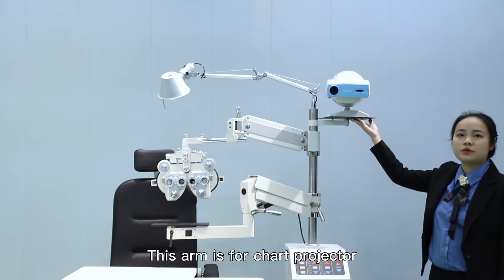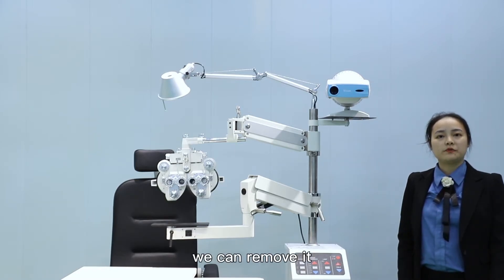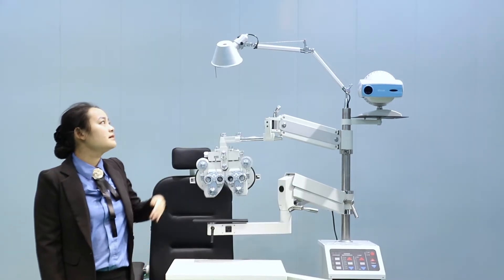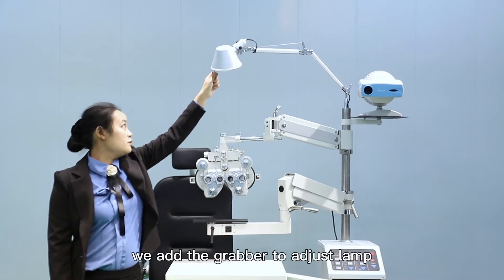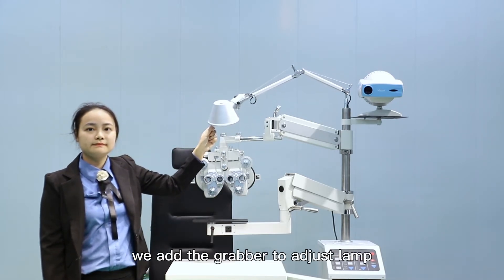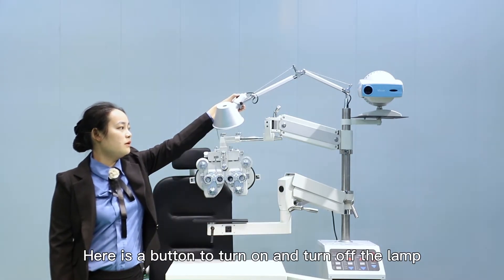This arm is for the chart projector. If you don't need it, we can remove it — it's optional. This is an overhead lamp. We add the grabber to adjust the lamp. Here is a button to turn the lamp on and off.